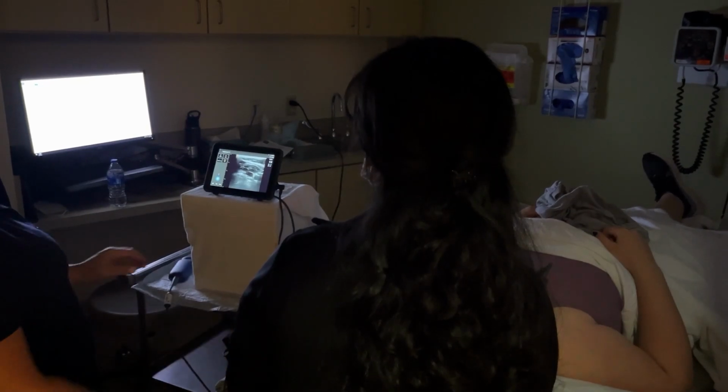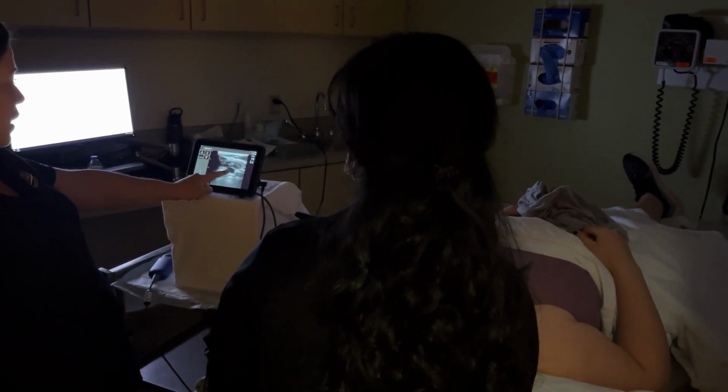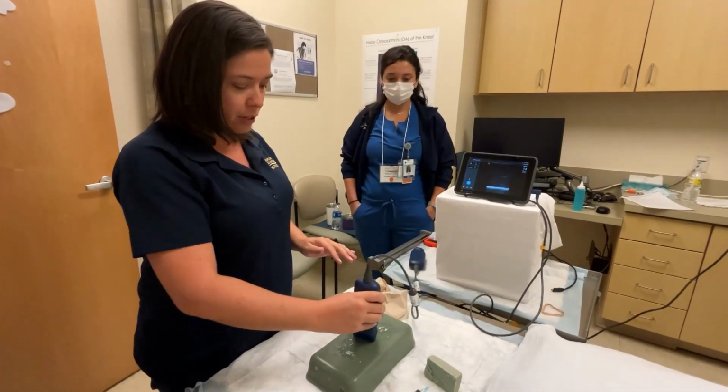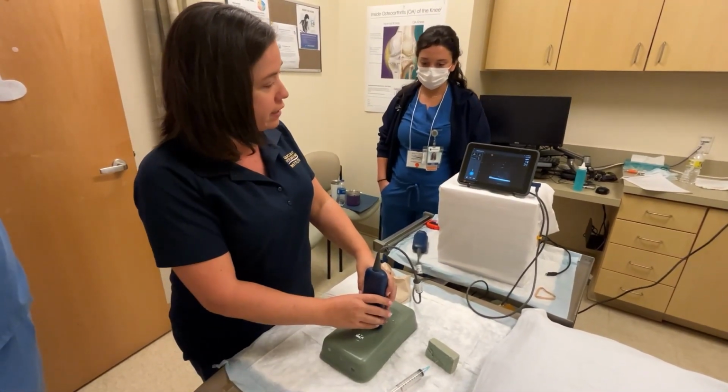What you'll be seeing is her carotid, which is here. Here's her jugular. You should give them your phone and have them take you while you do it. Can't see it. Get all your gel all over your patient. Make sure it's nice and lubricated so you slide your probe around. You're going to find your vessel on the screen.